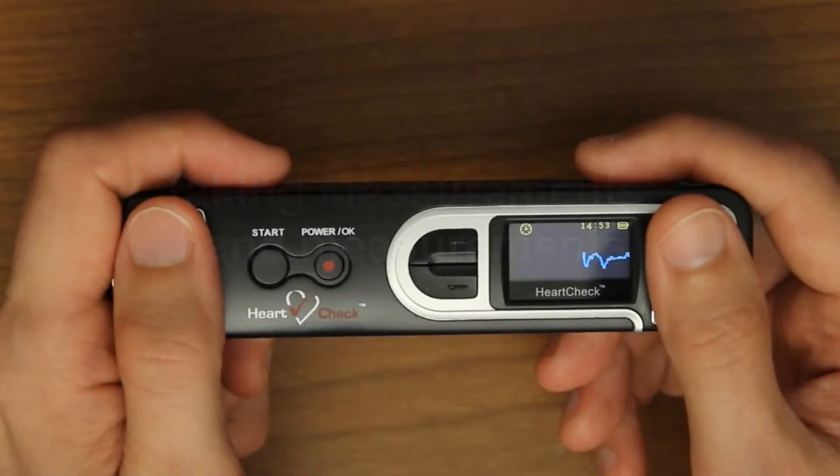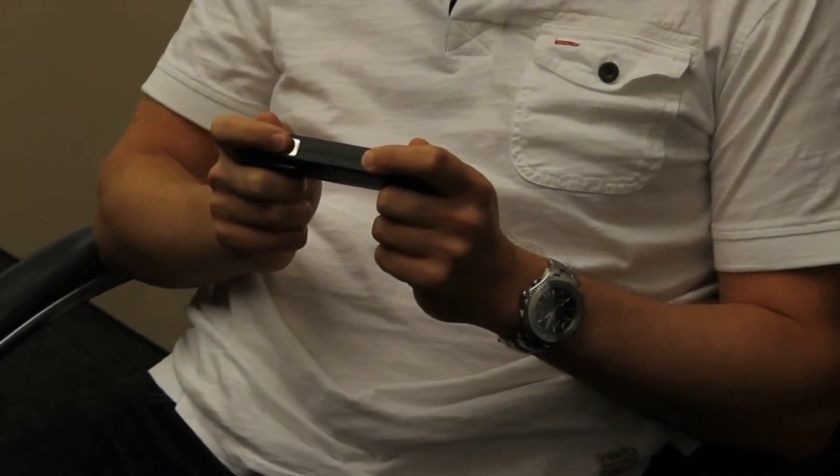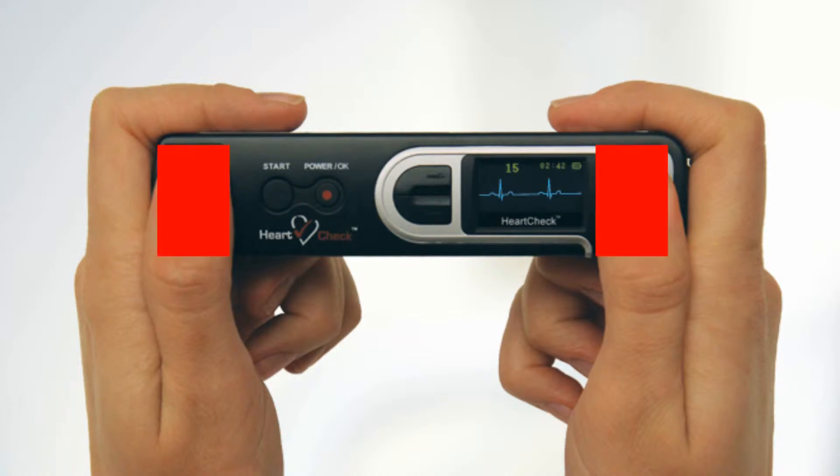Taking hand measurements. There are two ways to take a measurement of your heart using the HeartCheck pen device. The first way is a hand measurement. To take a hand measurement, hold the device ensuring the metal electrodes are in direct contact with your skin. Your right and left index fingers should make full contact with the metal electrodes located on the top and side of the device, and your left and right thumbs should make full contact with the two metal electrodes located on the front of the device.